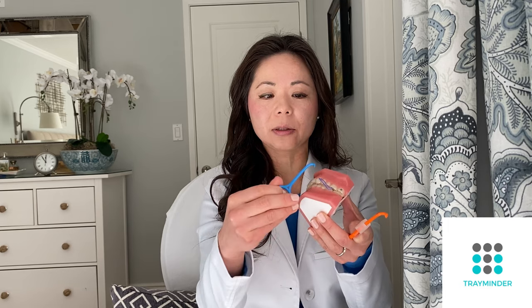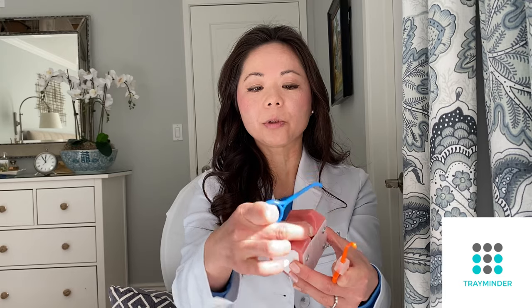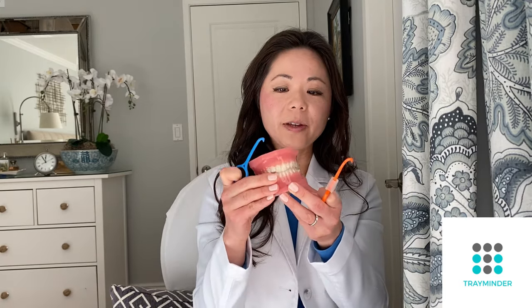Going back to these hook tools — if you're wearing rubber bands, you can use the hook to unhook and remove your elastics.